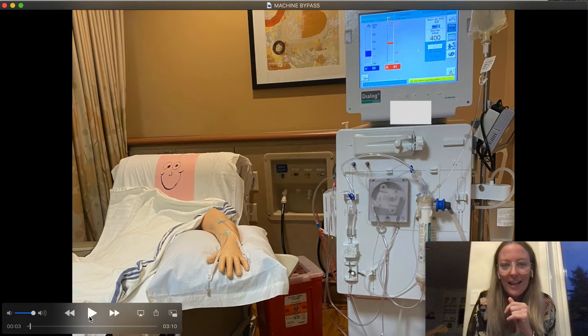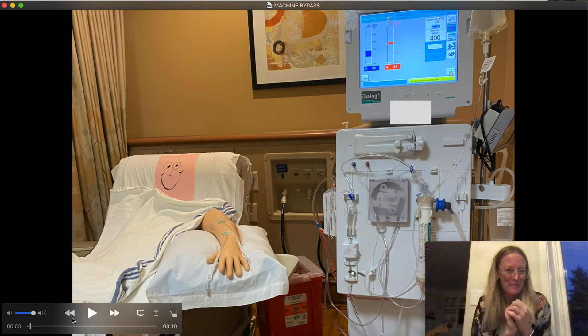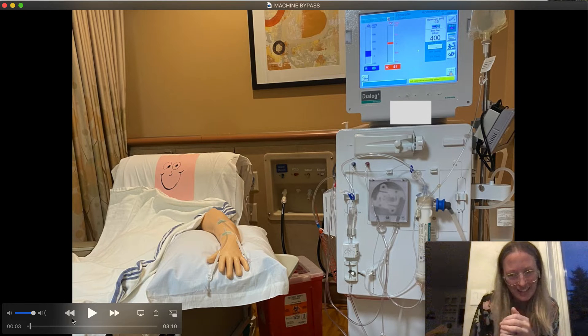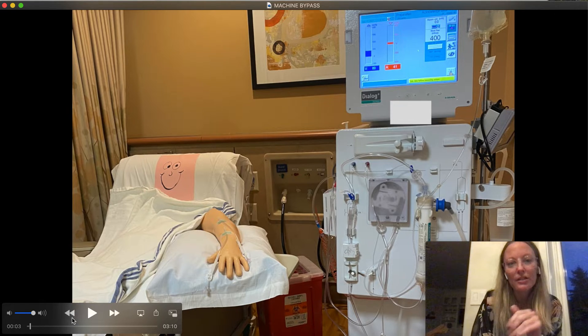The machine that I'm using is the B. Braun Dialog Machine, and as you can see I have a real life fake dialysis patient, but I do have a real life dialysis machine. Obviously there is no blood in the machine, but we will get started.